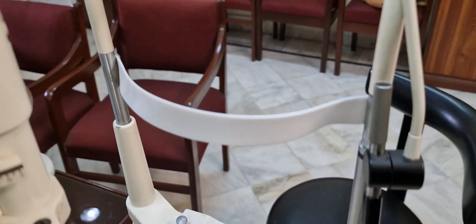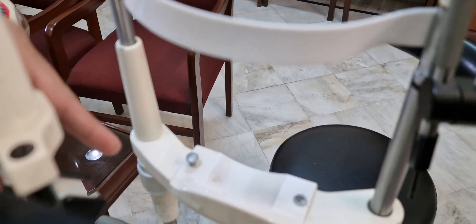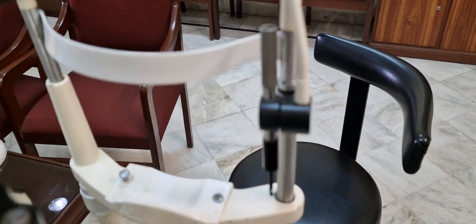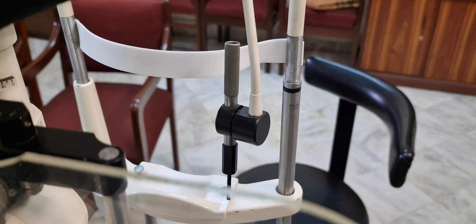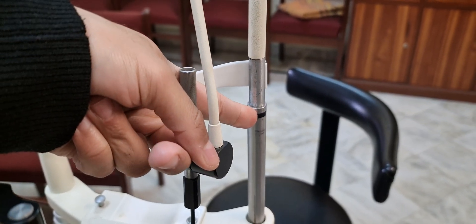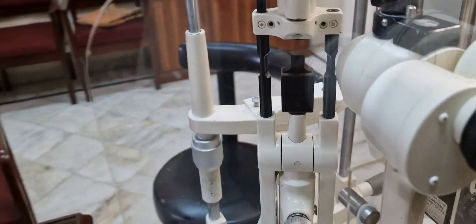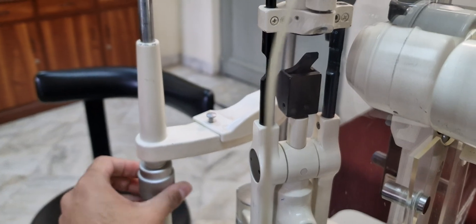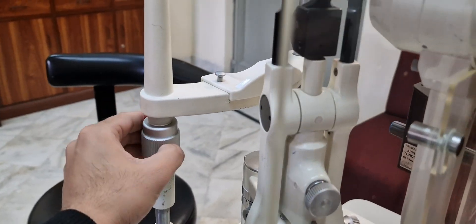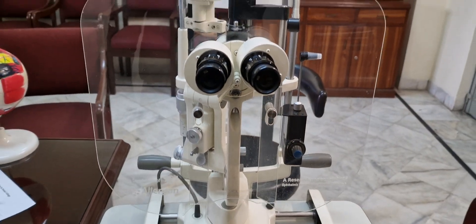Some other parts: this is the headrest, and this is the chin rest. You can see there is a fixation target given to the other eye so the patient does not move their eye. There is a lateral canthal margin adjustment present here. Another portion is the rotatable chin rest, which is moved to adjust the head position.